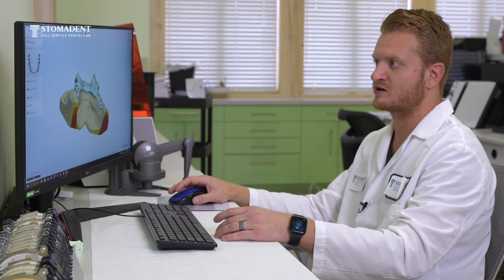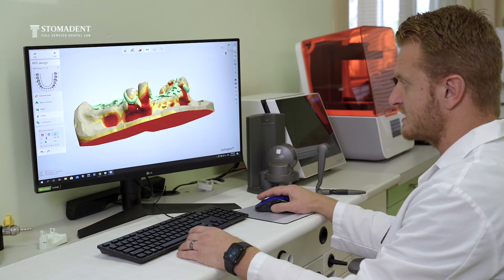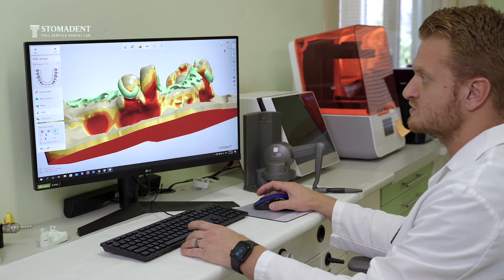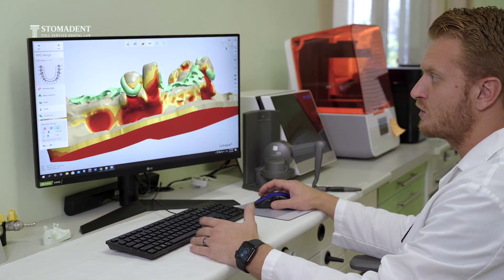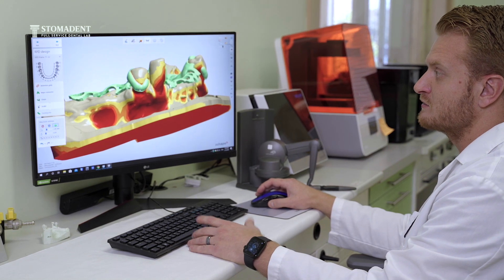The great thing about them is that as we're designing on our software, we are able to utilize more of the undercut as we are designing the clasps, which means we can also place the clasping much lower and closer to the tissue level, making them less visible.